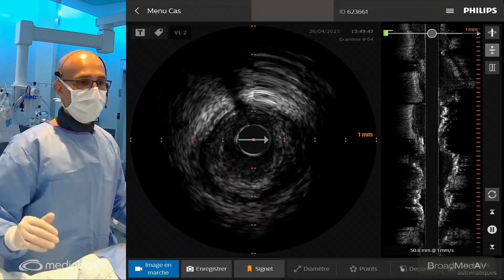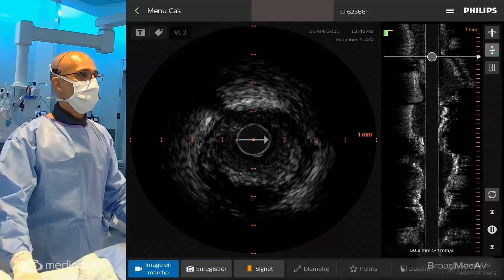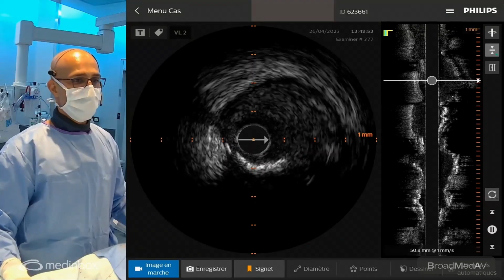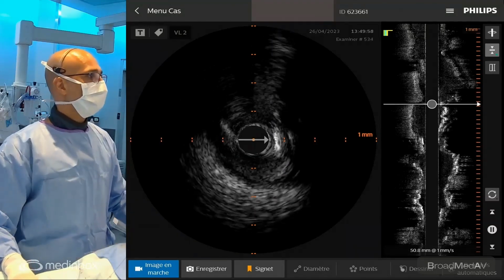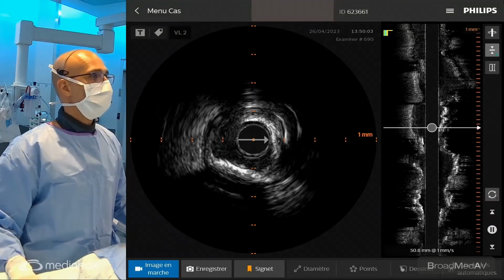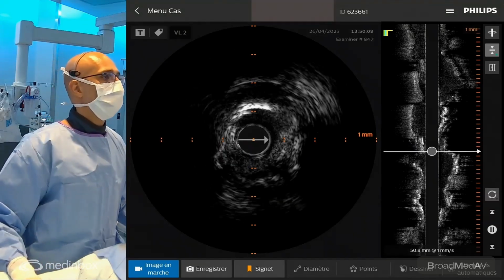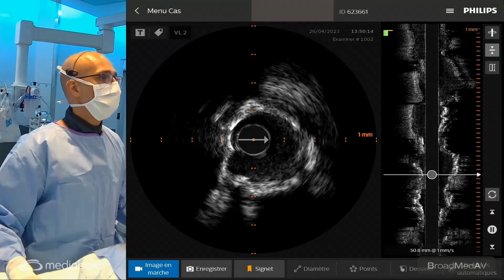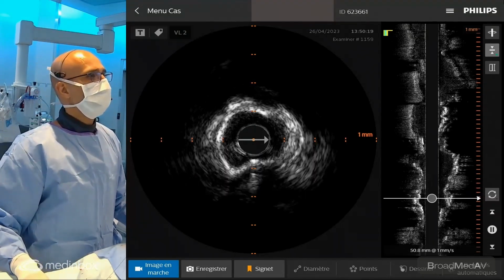So at this point, I had used orbital atherectomy already, which is known to get to the deep calcium. And following that, we decided to use lithotripsy. So we took a Shockwave balloon, 3.5. We performed one cycle at the mid segment. Can we see the Shockwave expanding? So this is a 3.5 by 12 by 15 balloon. Then we went proximally. As you can see, the waist is expanding gradually. I performed at least 4 cycles in the ostium.